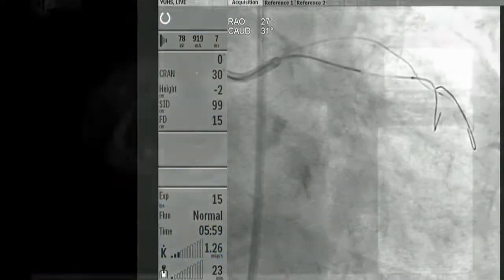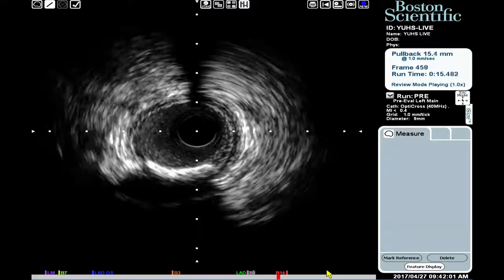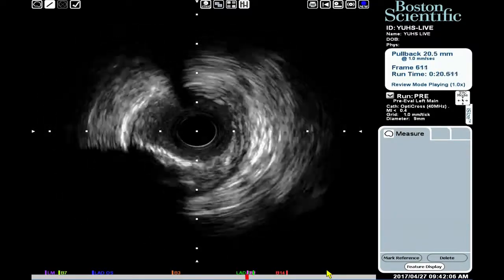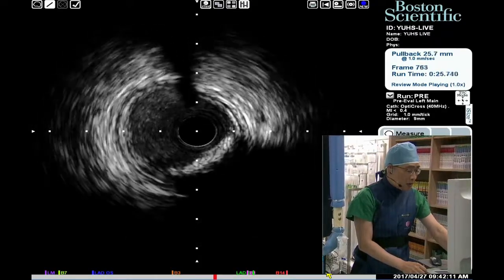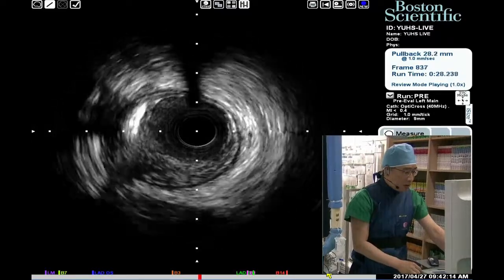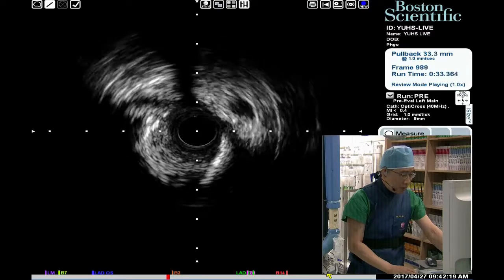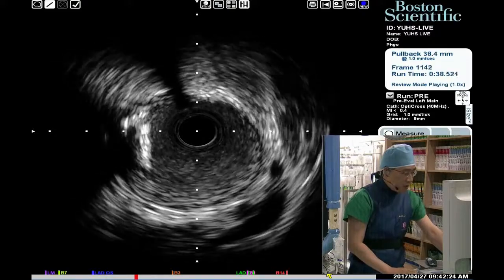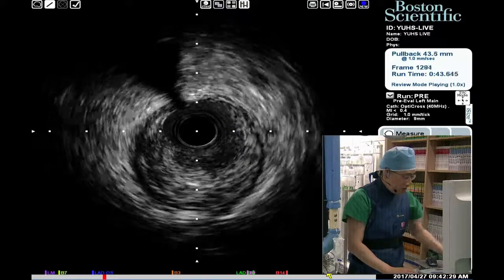Oh yeah, I'm Jung-Sung Kim. I will explain the IVUS findings. So we pull back the IVUS to the distal LAD as shown in this image, distal reference around 3.5, and there is a calcified plaque shown between 3 and 6. There is a lot of calcification in this patient. This is a pullback. This is the LAD region. The minimal lumen area was 1.7 and approaching to the LAD ostium as shown in this image.